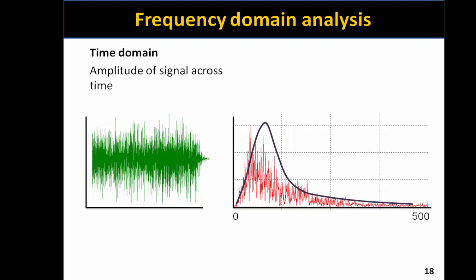If we are examining the EMG signal in the time domain, time is going to be along our x-axis, and what we are evaluating is the amplitude of that signal over time. And so our units here are volts. Here we see a raw signal, and as we progress forward in time, we can use the techniques that were discussed on the previous slide.